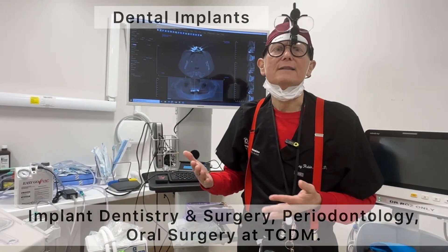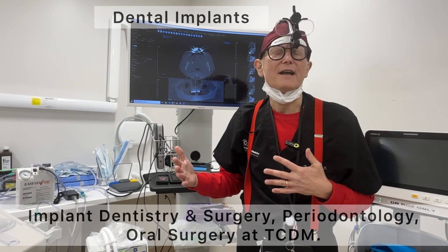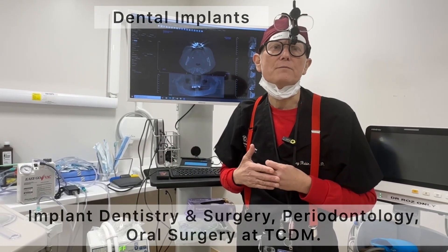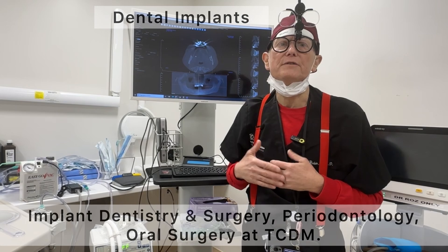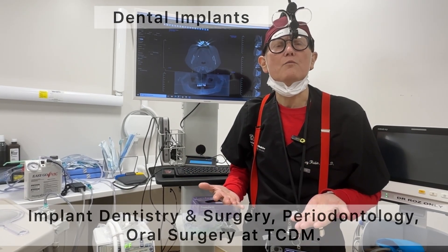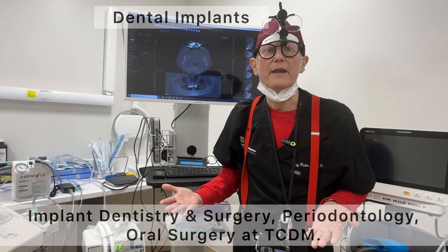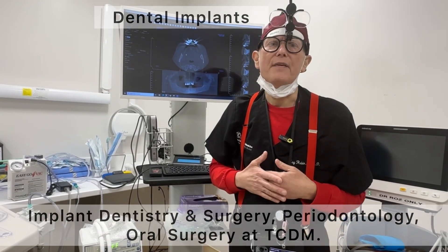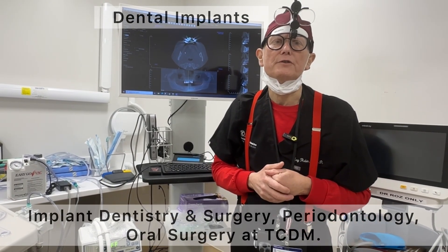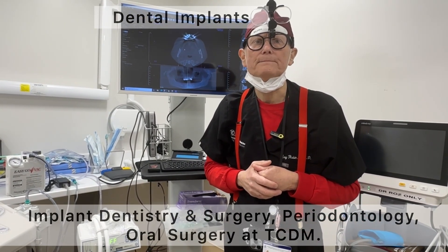The goal of surgery is not to be the most invasive surgery, but it's actually to be the least invasive surgery. Because we've been able to design it this way, we've been able to create a much more comfortable environment and result for the patient, and that's really changed how we've approached our surgical and prosthetic endeavors here at TCDM.